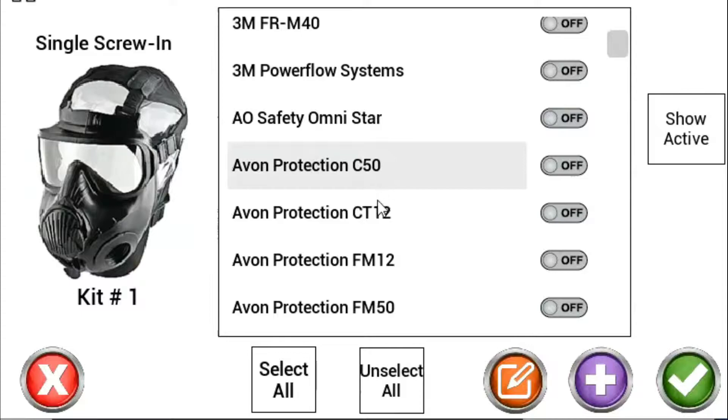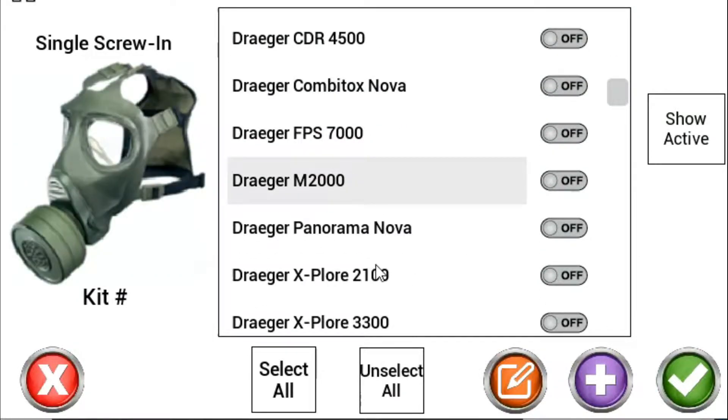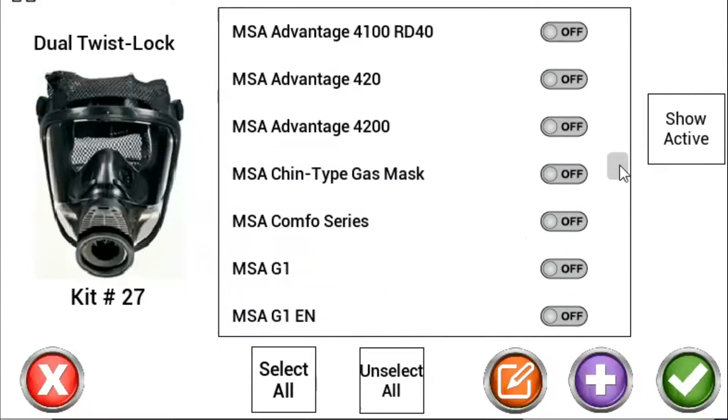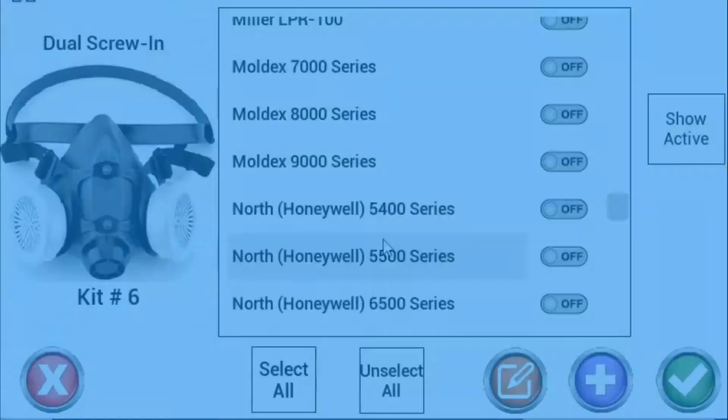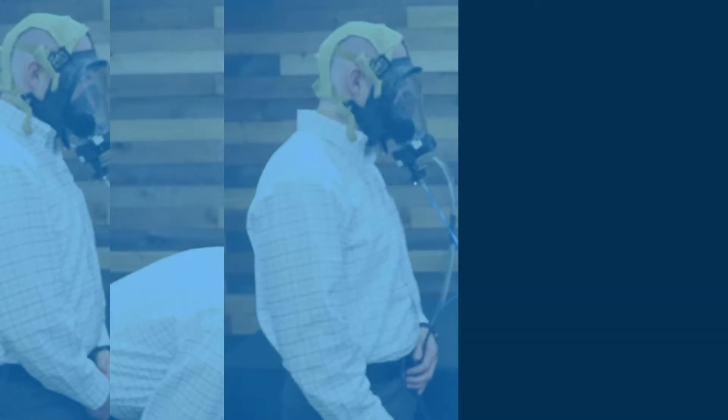Easily navigate the OHD Logic software with pre-populated respirator images to choose the respirator you will be fit testing. Perform an OSHA, NFPA, and ISO compliant fit test in as little as 2 minutes.